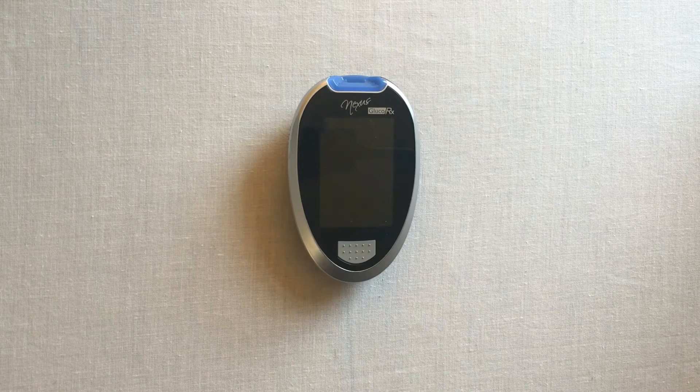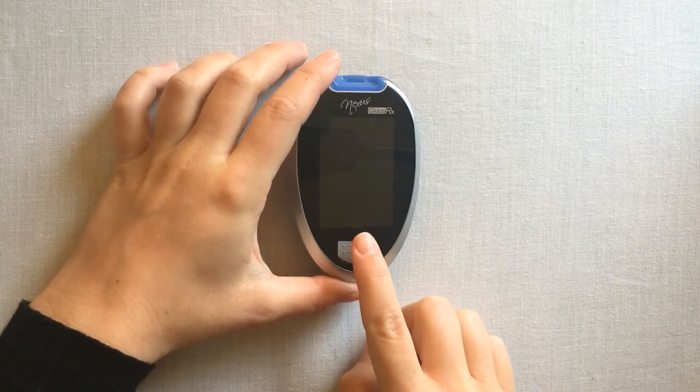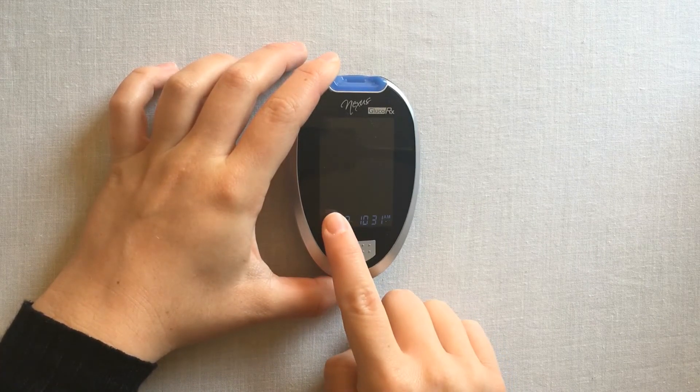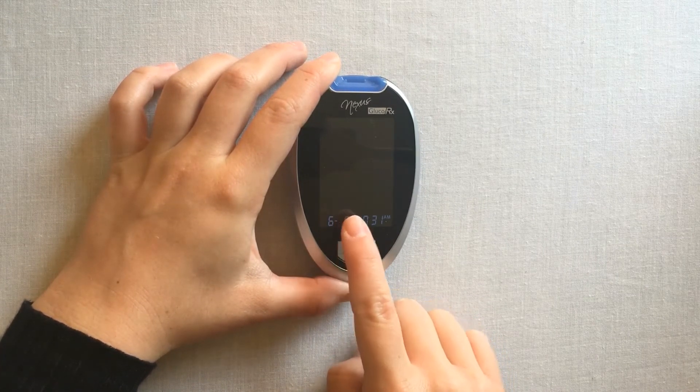Turn your meter on by pressing the main function button. You will see a flashing M for meter memory. To review your meter memory, press the main function button.